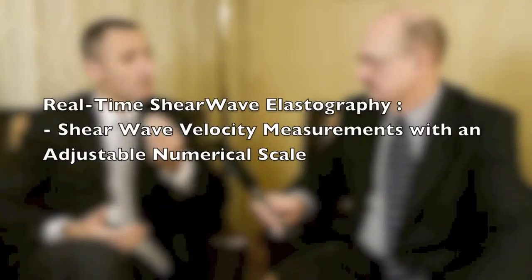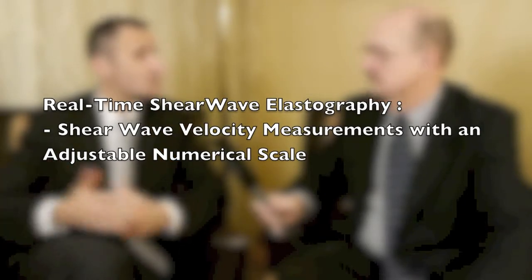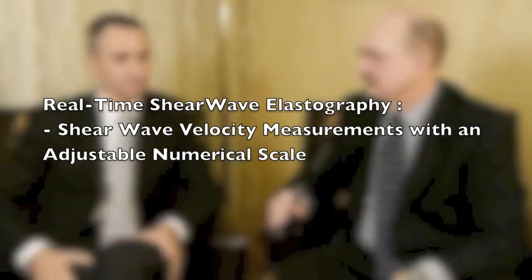In B mode, you may want to adjust your dynamic range. In color Doppler, you may want to adjust your dynamic range depending on the speed of blood flow that you measure. Now in ShearWave, you get again that same capability of being able to adjust the dynamic range to see the exact optimal stiffness variation that you want to depict on tissue. That's a very interesting development.